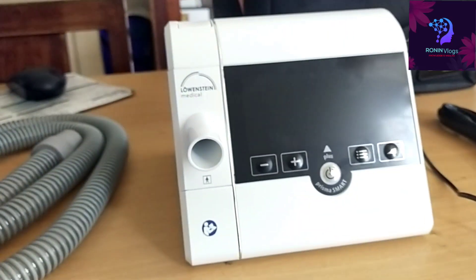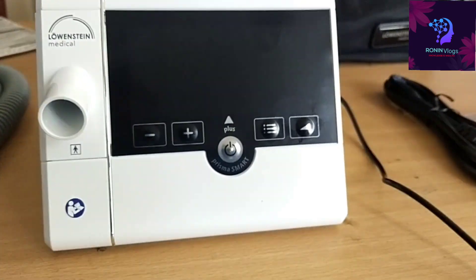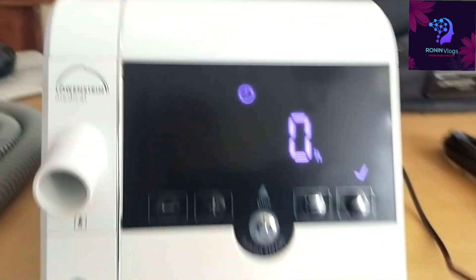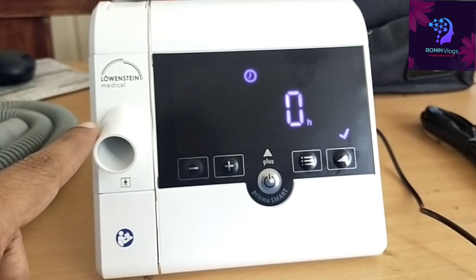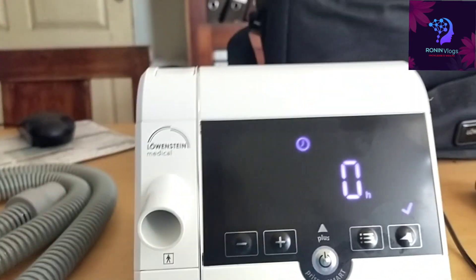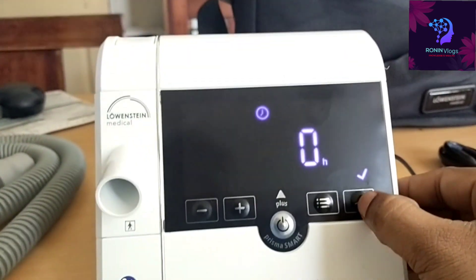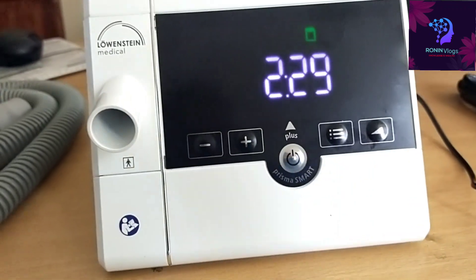This is the front side of the machine. This bag is also included together. Now we need to connect this machine to a direct power supply, then the machine turns on. Just press the tick button — this is not touch, you need to press the physical buttons. Now the machine will show the time.